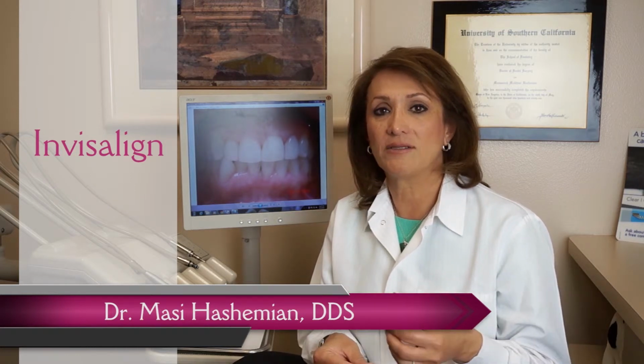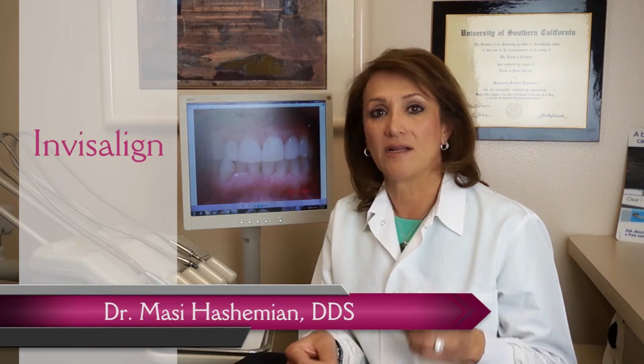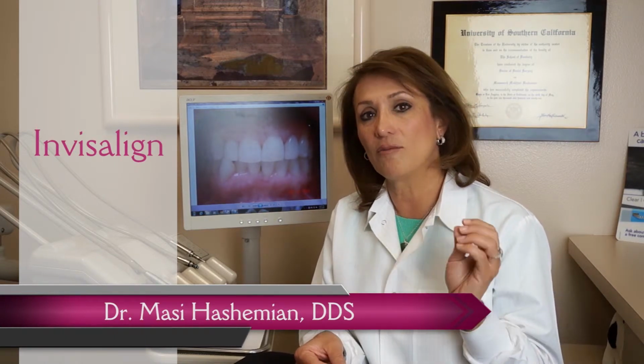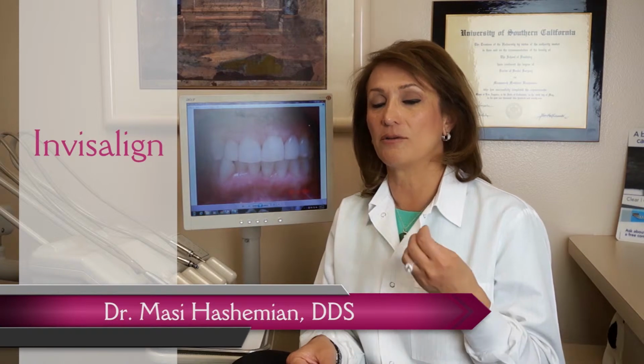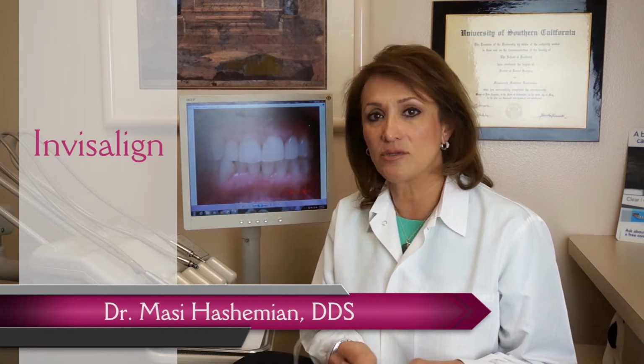If you take it out and keep it in your pocket or in your purse, it's not gonna work. And the teeth are gonna move back, not necessarily to where you started from, to somewhere that it wouldn't even fit your aligner later. So if you're deciding and investing in Invisalign, you should follow the direction and wear those aligners 20 to 22 hours per day. That's the only way it works.